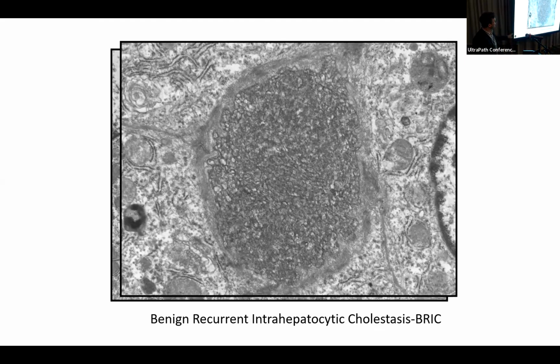I do want to mention that there's also PFIC2 and PFIC3, and neither of those have any specific bile morphologic changes.